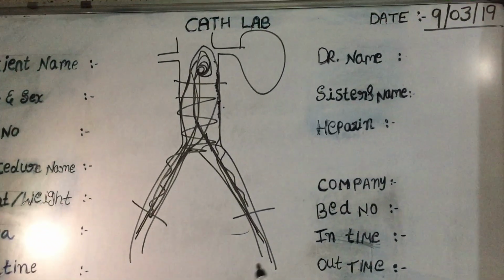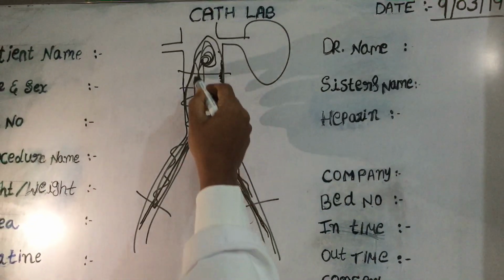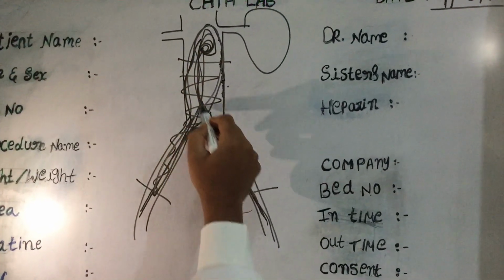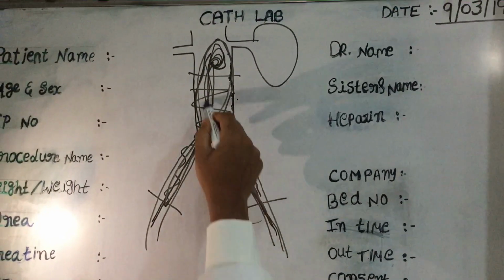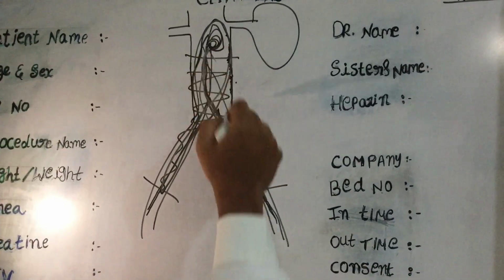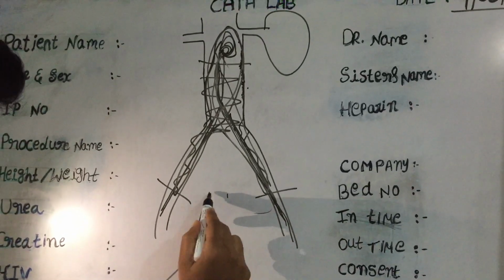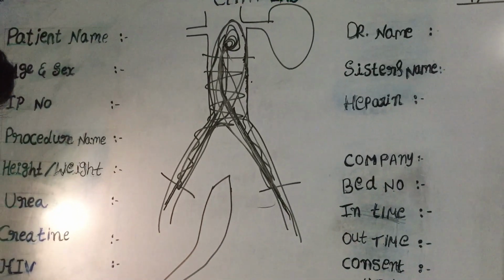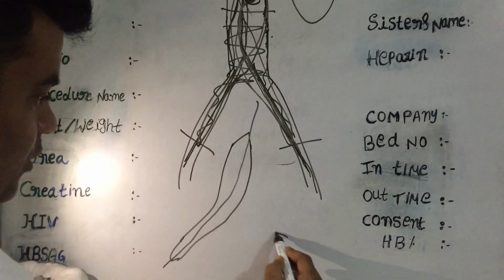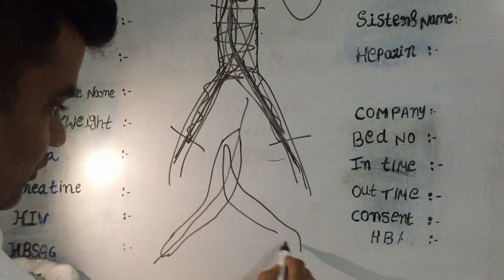Once we have done that, we take a balloon over this 14 wire, and we get our balloon into here. So one balloon is there which you have punctured, and the second balloon goes inside the balloon, and now you do an angioplasty. So this is called balloon in balloon angioplasty, because there is a balloon here, and you have punctured this balloon and put another balloon inside it.